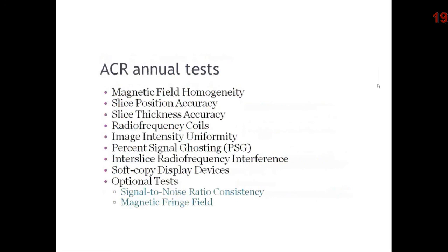The ACR requires the following tests to be done on an annual basis to meet the ACR MRI accreditation standards. These are tests done by a medical physicist or a system engineer and assisted by an MRI technologist.